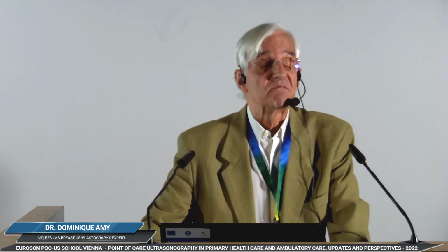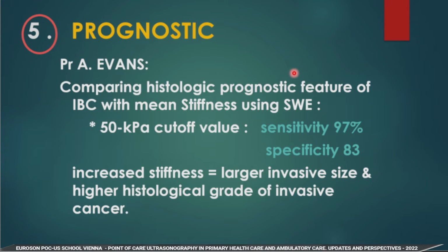Another very fascinating power of elastography is to help you make the prognosis of the tumor. Professor Evans, several years ago, did very interesting work comparing histology and the elastography of the shear technique, and he has a cutoff value of 50 kilopascal.